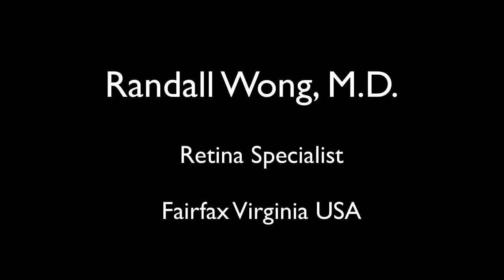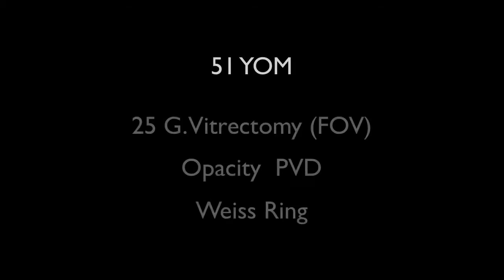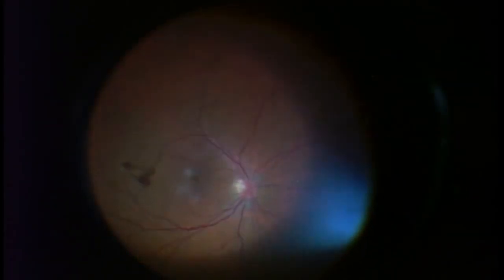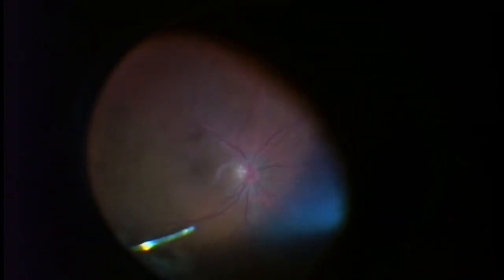This is Randy Wong, a retina specialist in Fairfax, Virginia. This is a 51-year-old male in whom I recently performed a 25-gauge vitrectomy. As you can see, he's got a very large opacity centrally, and that circular area is a gigantic Weiss ring. The first thing I noted when I started the operation — which is why I chose this for the video — is the enormous shadow it casts on the retina.